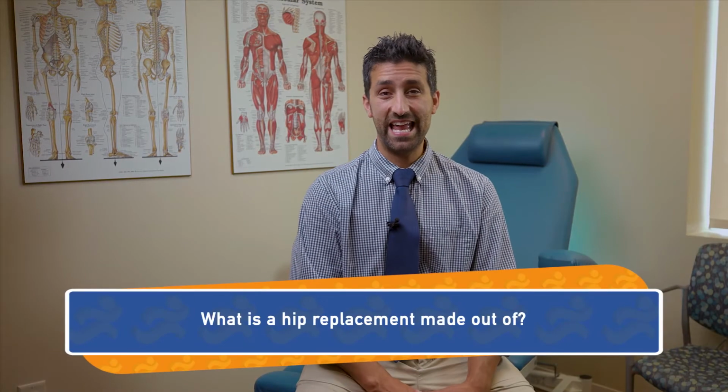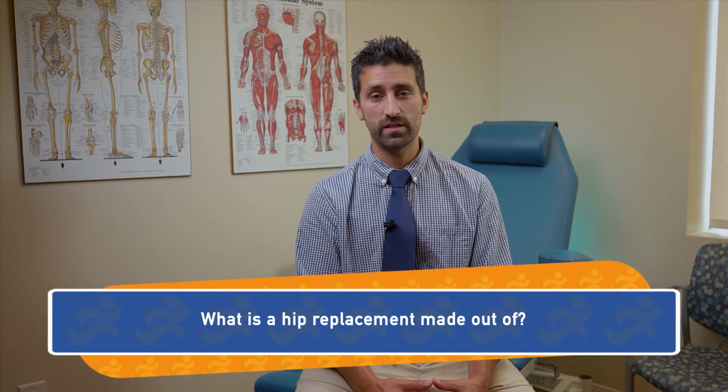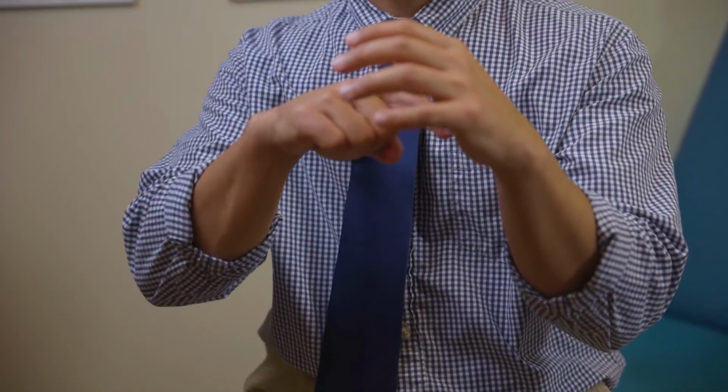What exactly is a hip replacement made out of? Well, a very technical question, but the hip replacement is made out of a couple of different components. So the hip is a ball and a socket. The socket portion is made out of titanium metal, most commonly. The femur has a titanium stem. The head is either a cobalt chromium head or a ceramic head. And then between, in the socket, is a very highly machined, highly manufactured polyethylene plastic, where the head then rotates on and your hip is able to glide around.